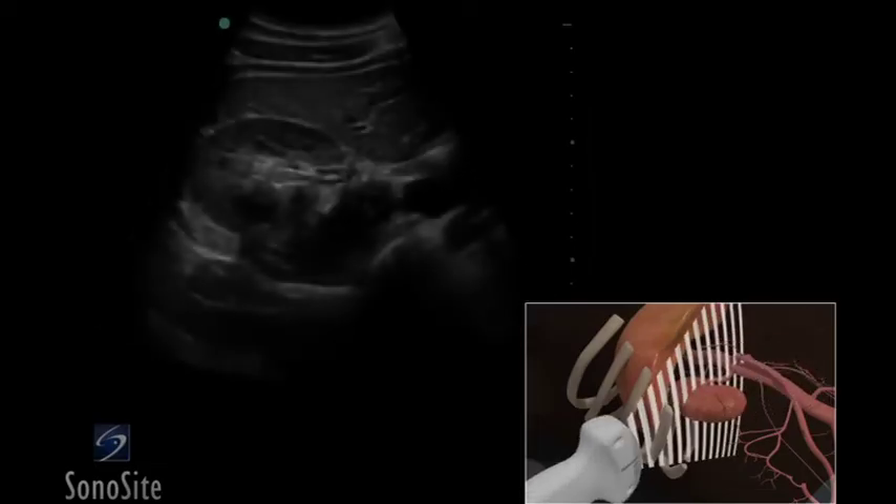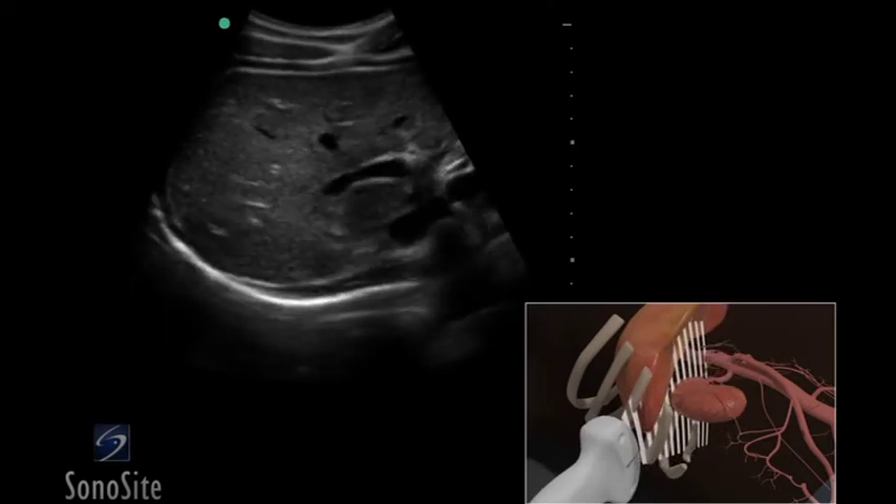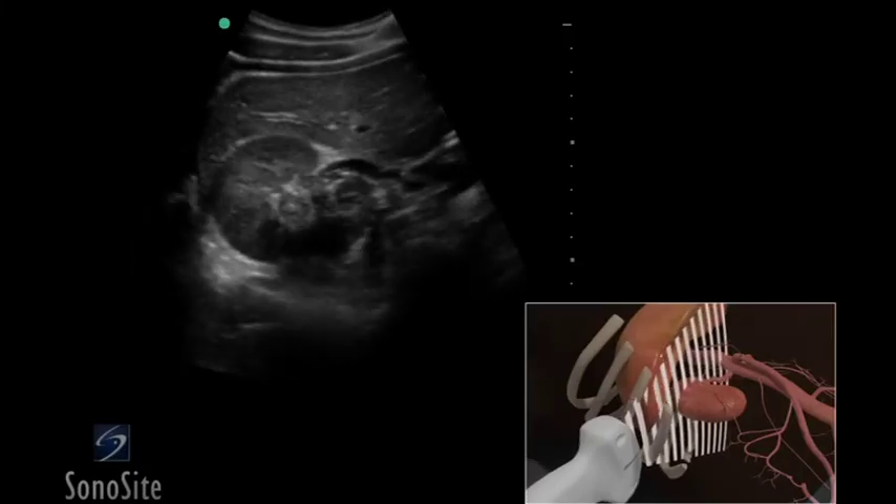To obtain a transverse axis view, rotate the transducer 90 degrees from the long axis position. The kidney appears as a circular structure with a horseshoe shape at the level of the renal pelvis. The transducer is swept from the superior to inferior poles to evaluate the entire kidney.